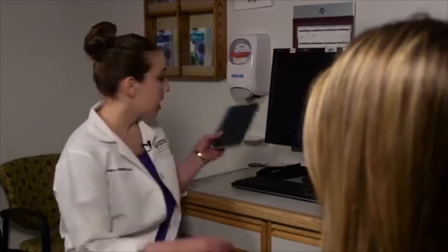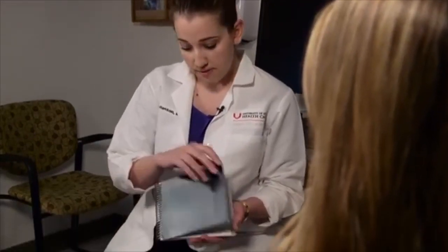We're going to start today with the Hardy-Rand-Rittler pseudo-isochromatic color plates. This is one way that you can test color vision. The nice thing about these plates is that they can screen for red-green defects and for blue-yellow defects. The Ishihara color plates primarily just screen for red-green defects.